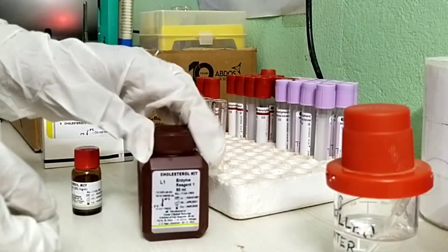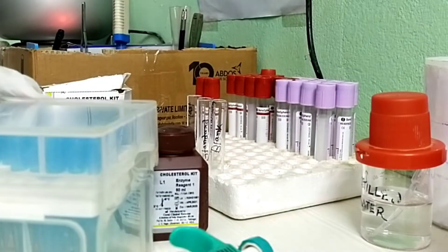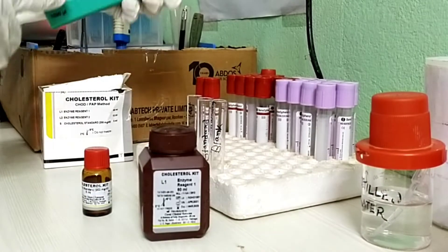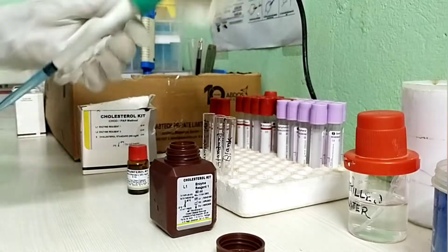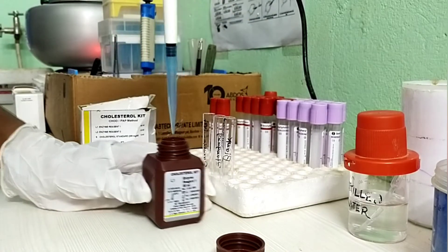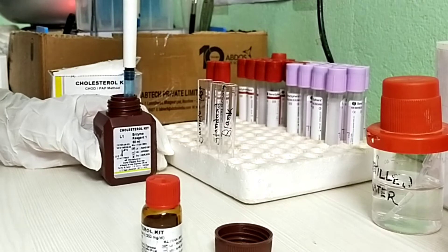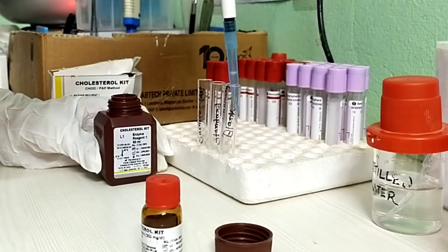This is cholesterol working reagent and this is standard reagent. Take 1000 micro liters of working reagent in each test tube. It must be observed carefully that there should not be any bubbles while pipetting.